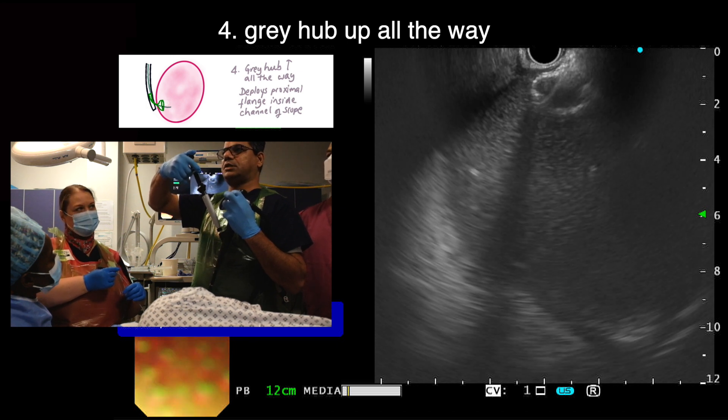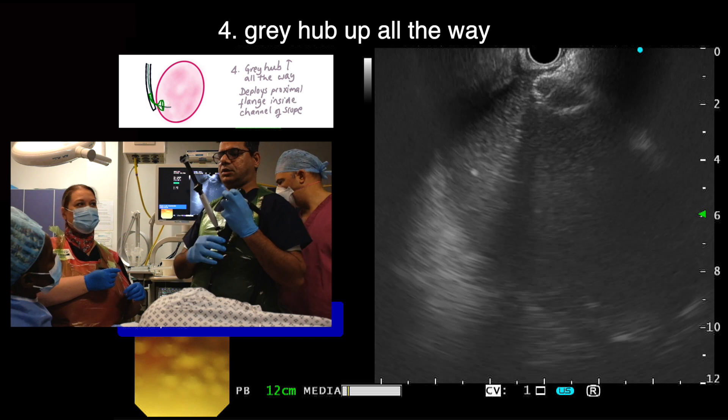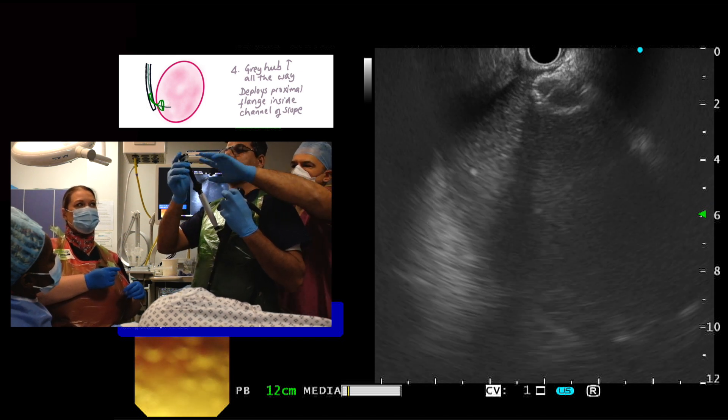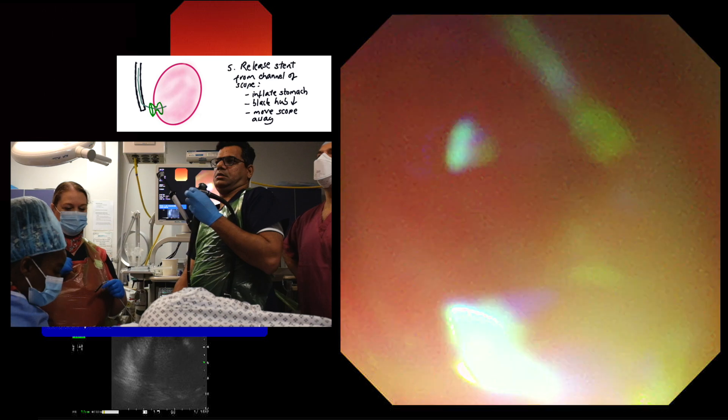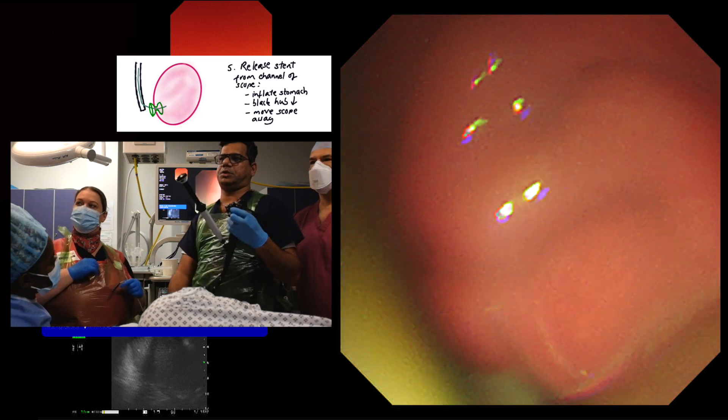Now the grey hub is moved upwards all the way to the top of the handle to deploy the proximal flange within the channel of the scope. The proximal flange is not visible on EUS. We now switch to endoscopic view and the stomach is inflated with CO2. The black hub is unlocked. To release the proximal flange of the stent from the scope, we move the scope away from the stomach wall and push the black hub down in a one-to-one movement. The deployed proximal flange was visible momentarily and there is a gush of cyst content into the stomach.